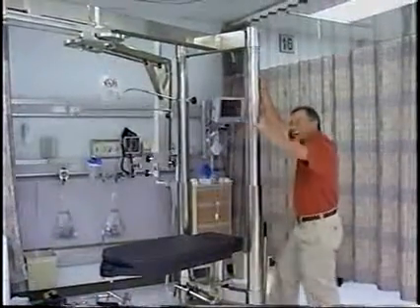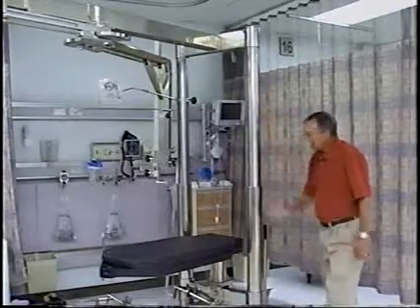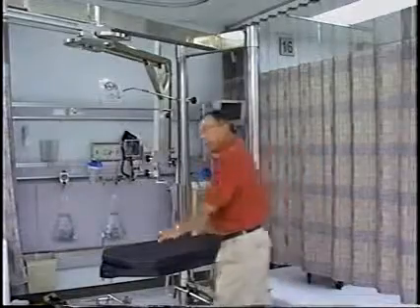See why it's important now to make sure you've got the lights where they should be? Okay, the top is starting to move up, so we'll stop pumping for right now.